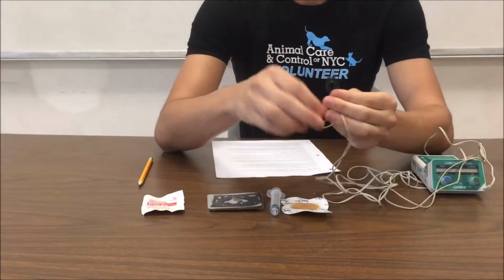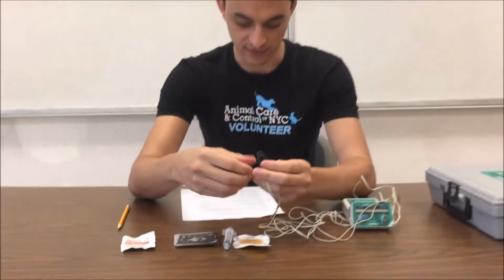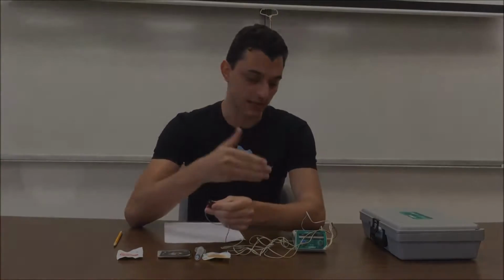But before we even apply any medication, we have to figure out how strong of an electrical current we need to facilitate the delivery. And we also have to figure out how long that delivery lasts. So let's take a look.